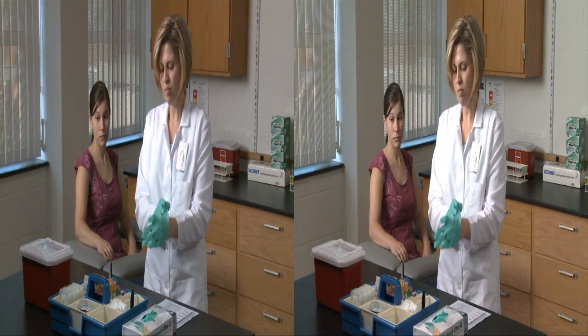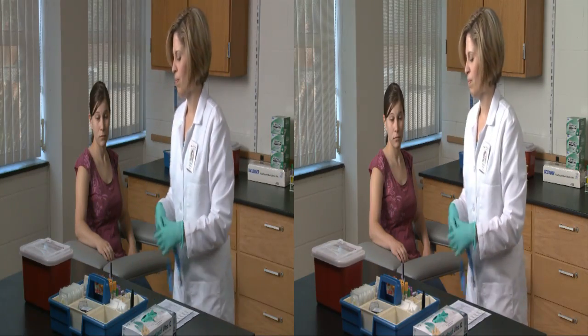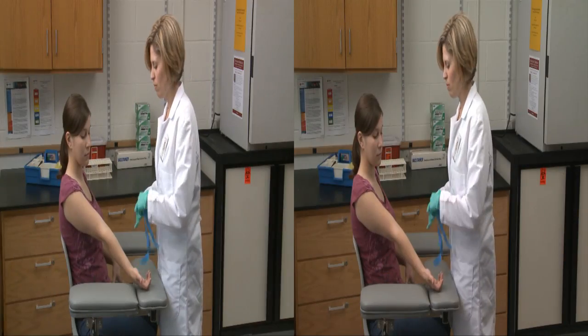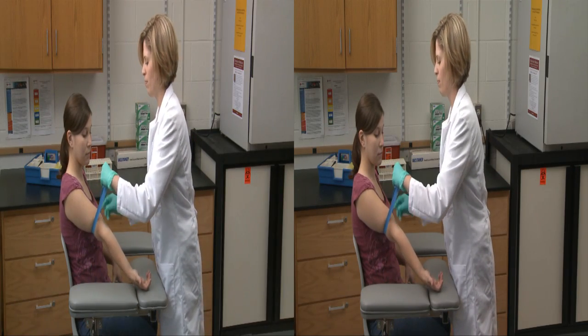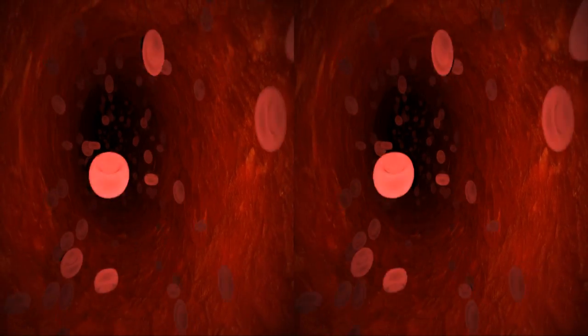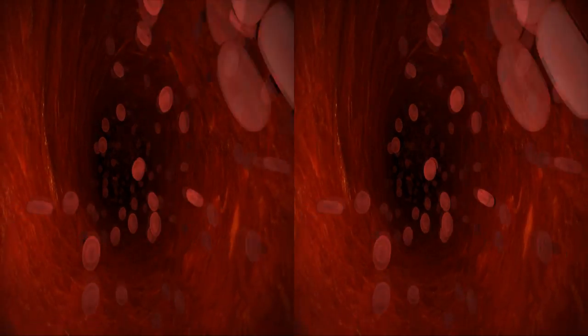Then speak reassuringly to the patient as you position him for the draw. Applying a tourniquet slows the flow of blood in the veins and increases venous filling, thus making the veins more prominent, easier to locate, and easier to enter. However, leaving the tourniquet on for longer than one minute may affect laboratory test results and should therefore be removed and reapplied if the procedure will take longer than one minute.